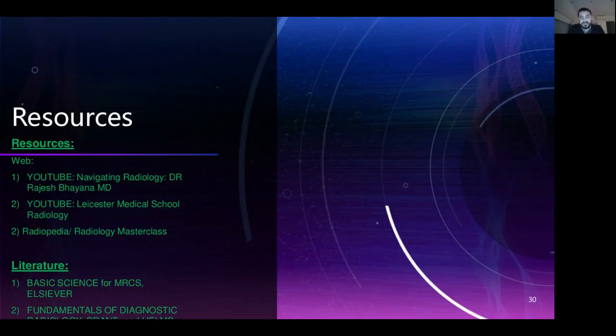So you can use it in specific cases, but it's very specialized. MRI in the context of the heart is usually used to look at scarring and fibrosis as a result of myocardial infarction.